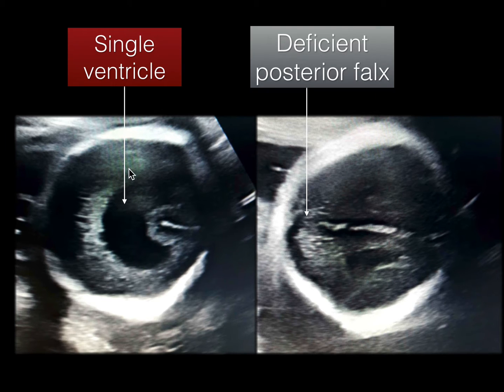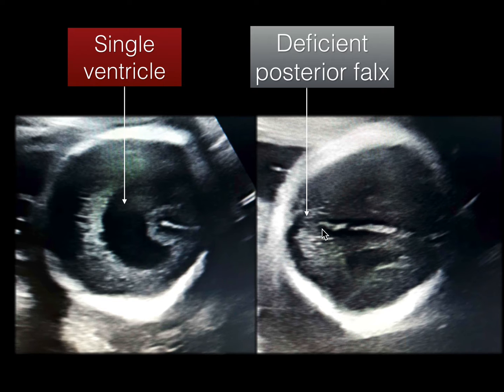A similar section lower down also shows the single ventricle and deficient posterior falx. You can see the falx is also irregular — it is not smooth and straight, and there is a deficiency of the posterior falx.